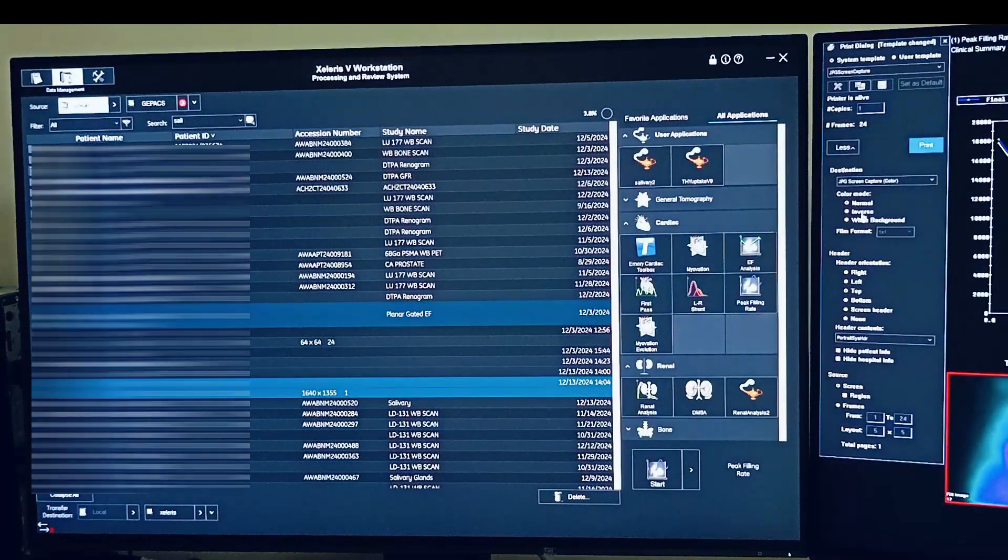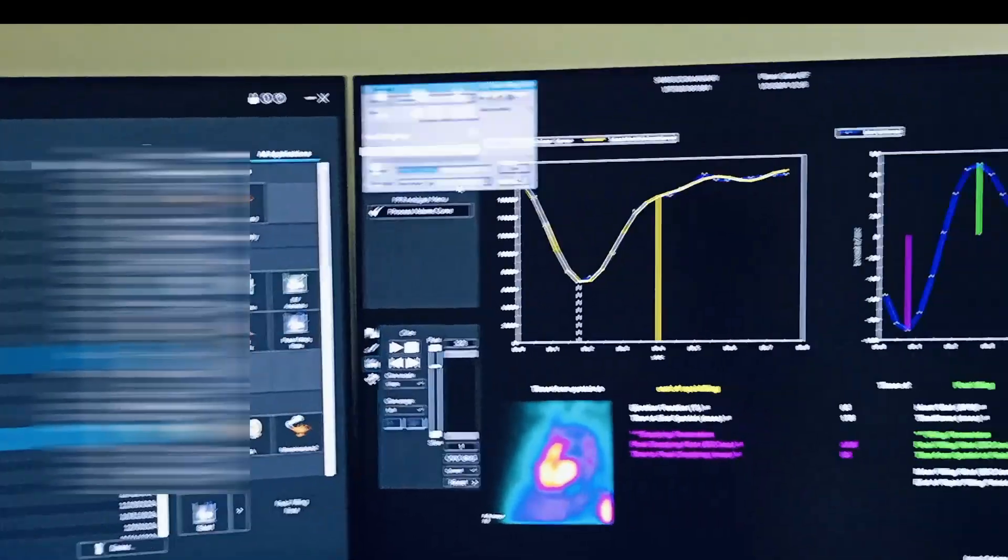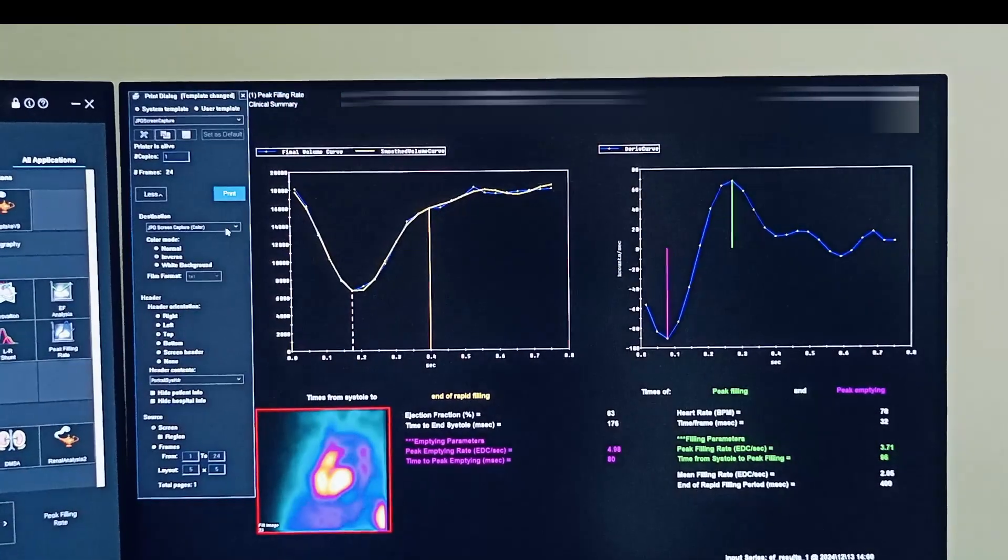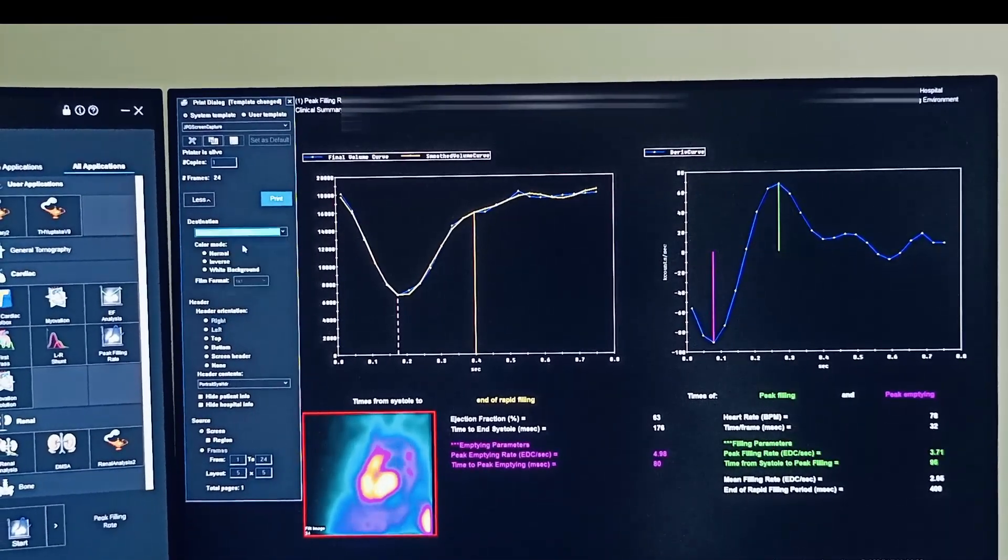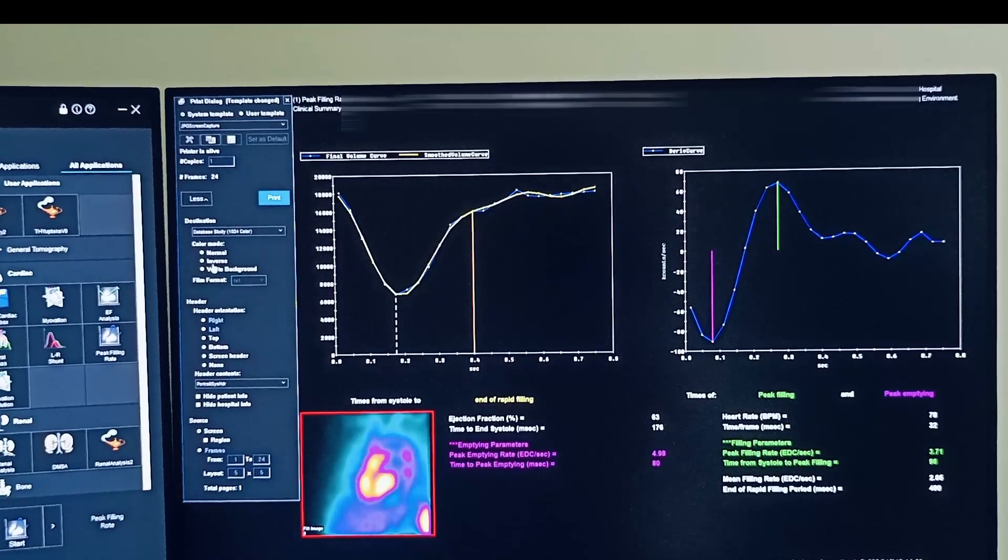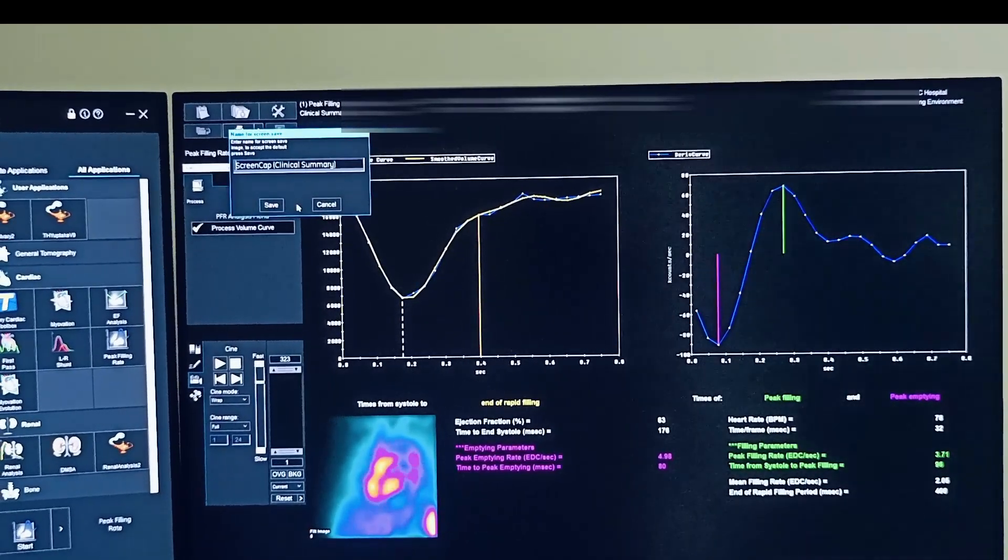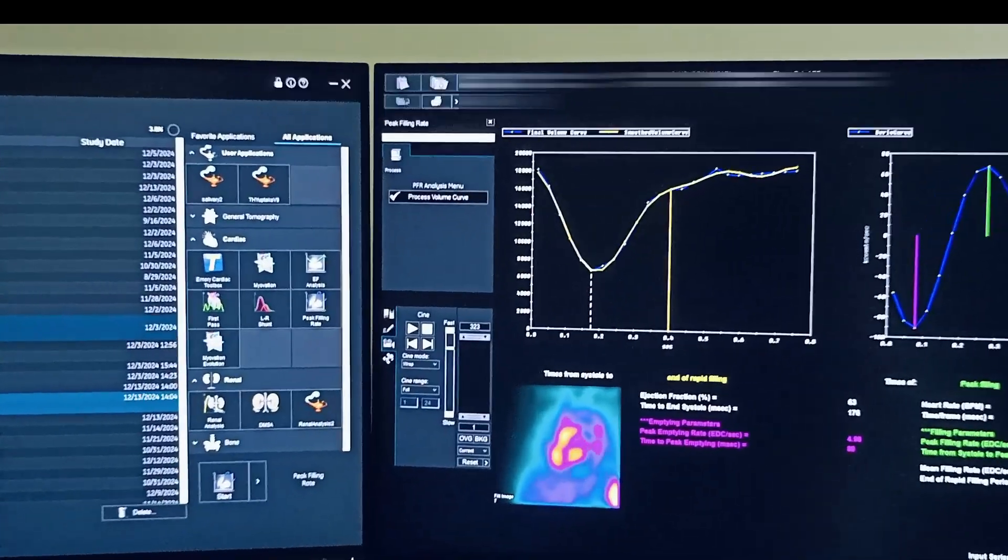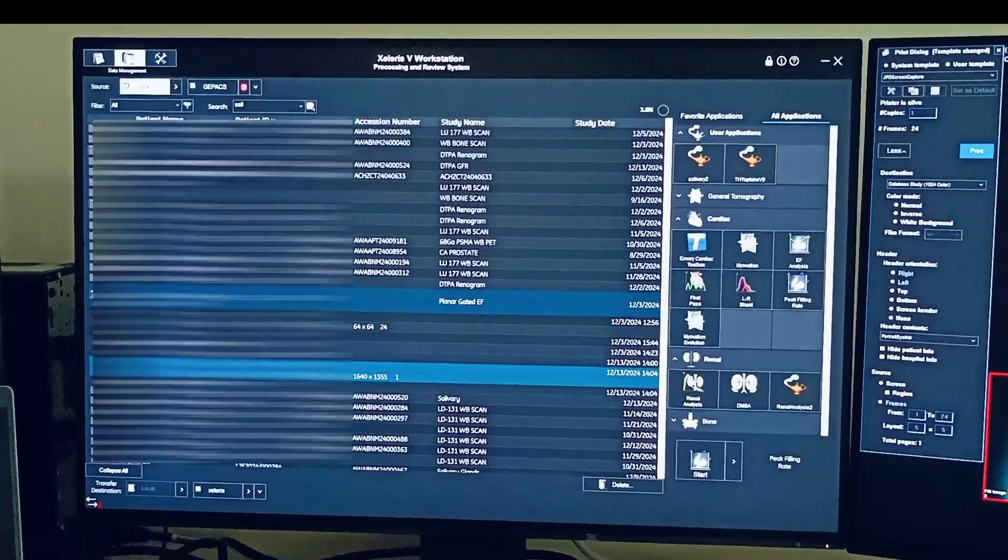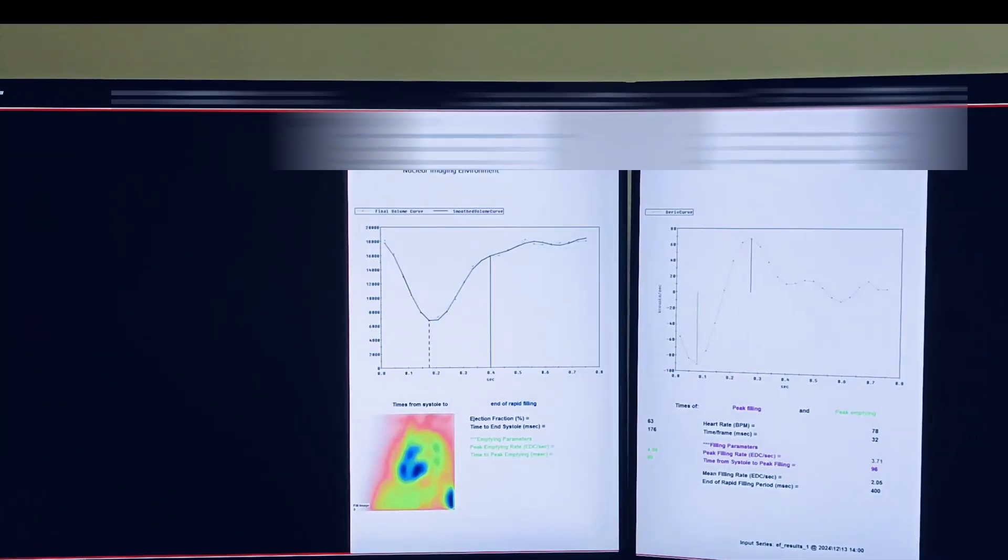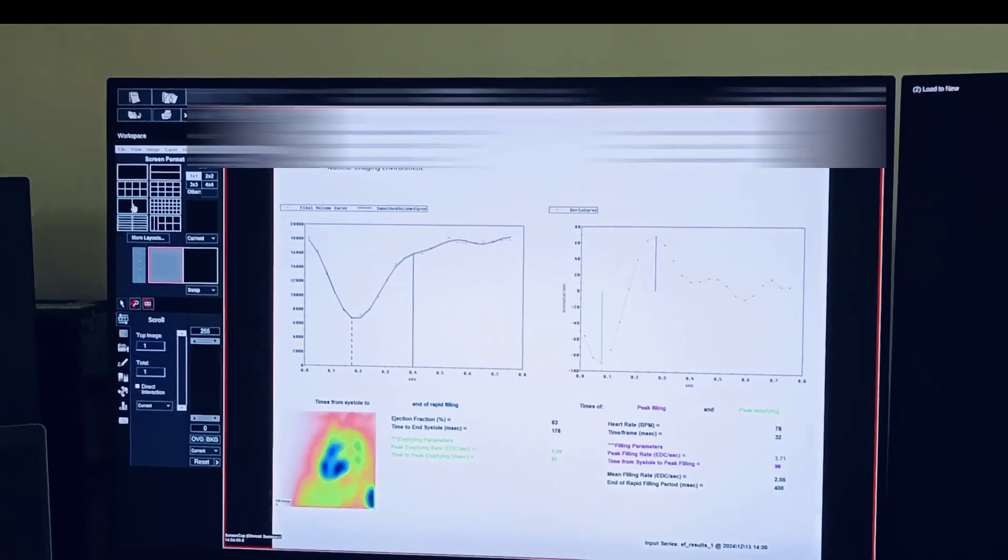So if you select inverse here, if you click inverse and database study, here inverse, then the color will change. See, with white background.